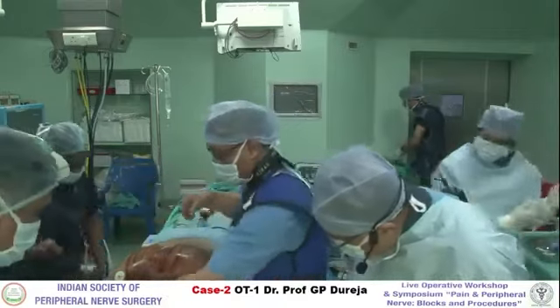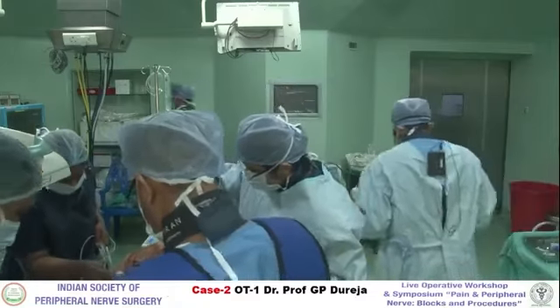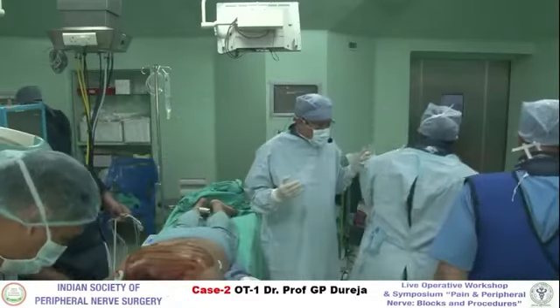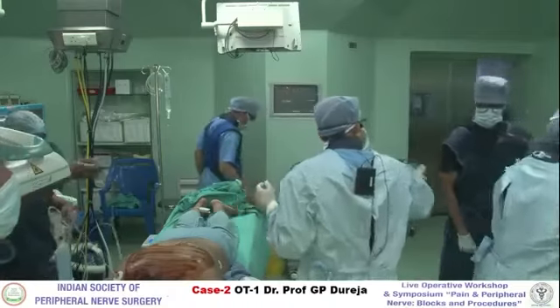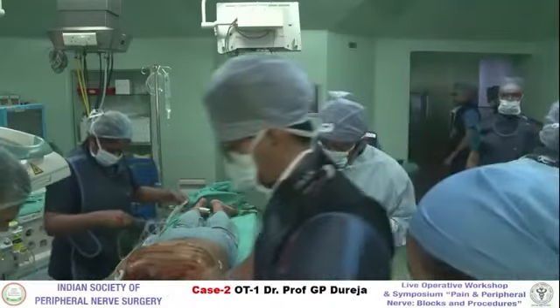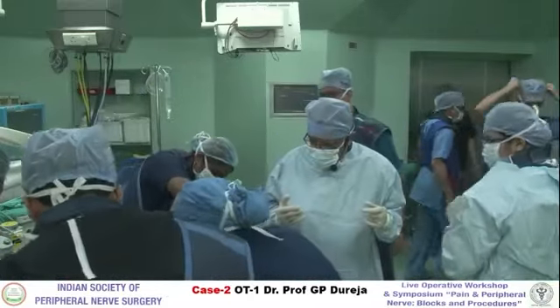It's usually less than a ml. So then no need to dilute it. In that case, obviously it is seen better. But sometimes we have used a double dilution of the dye, and the only advantage is that it easily clears. So if you need to reposition the needle, then you can see the needle tip. So sometimes you may double dilute the contrast agent.